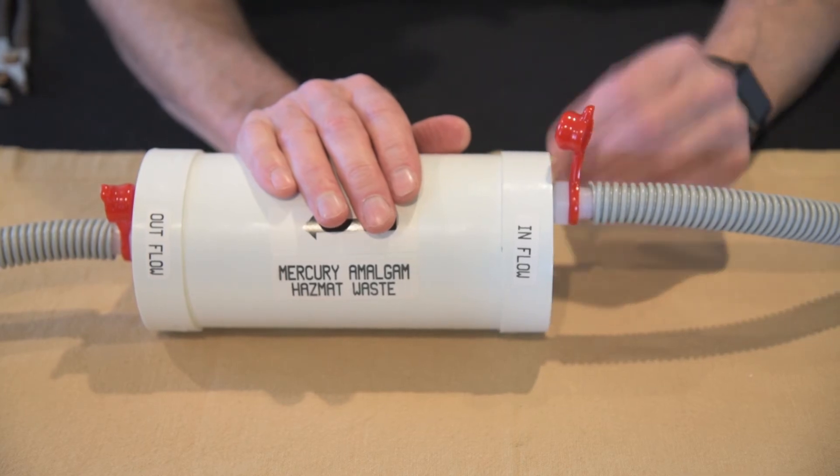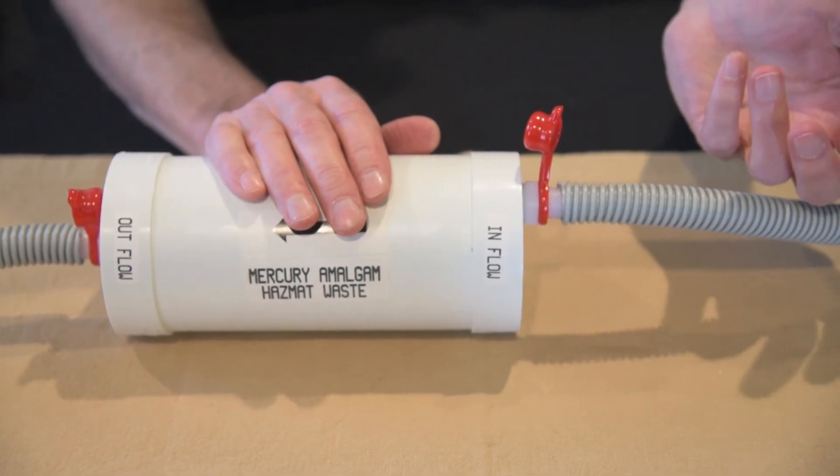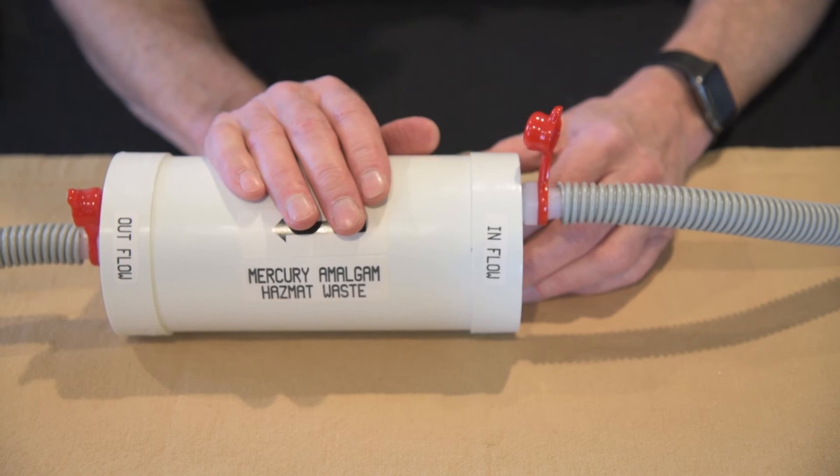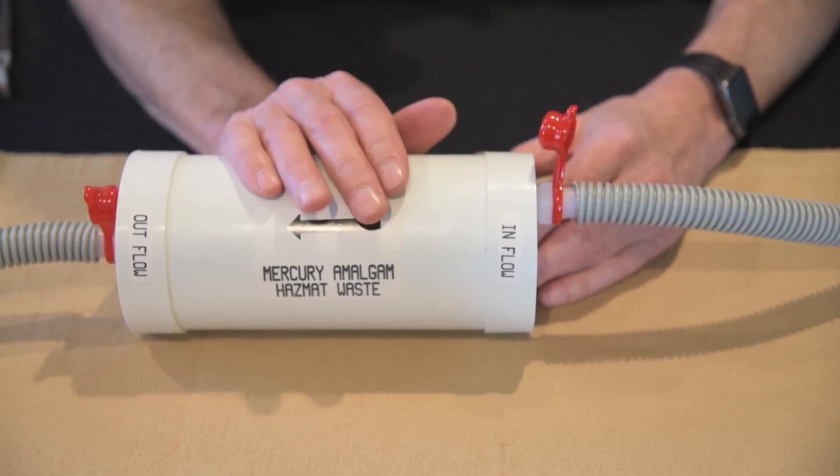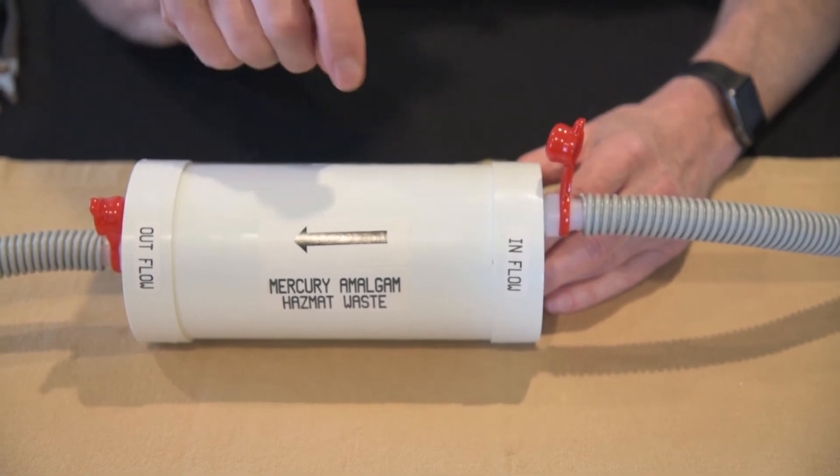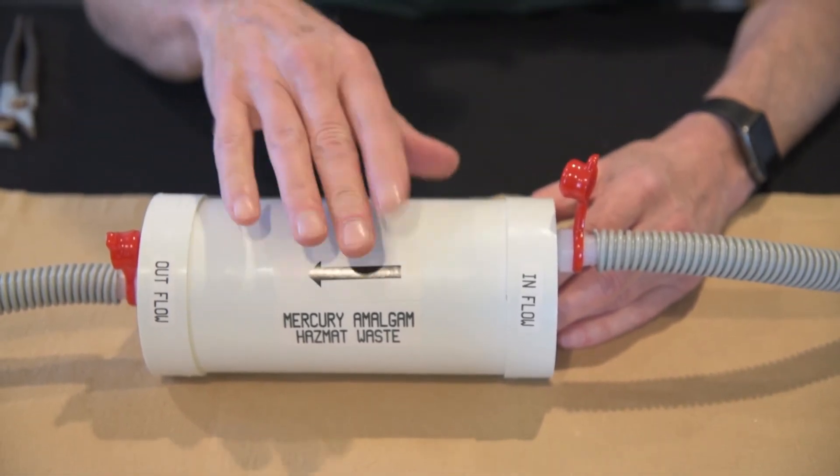The second thing is the sediment trap. Is the sediment trap full? Does it need to be replaced? So you do those two things first and check your vacuum power again. And if it is still weak, you know that you need to replace the filter.